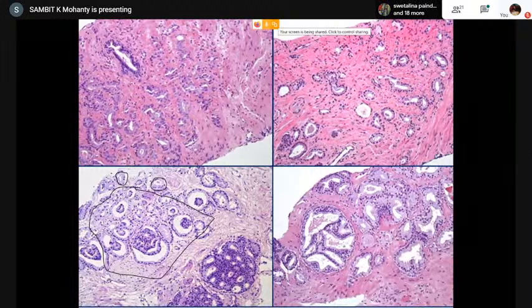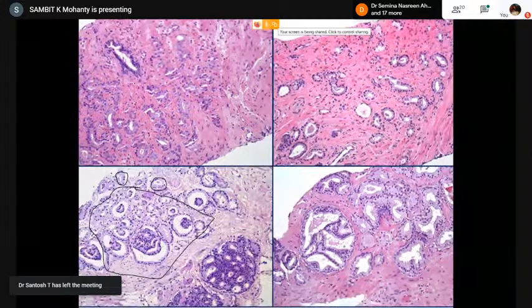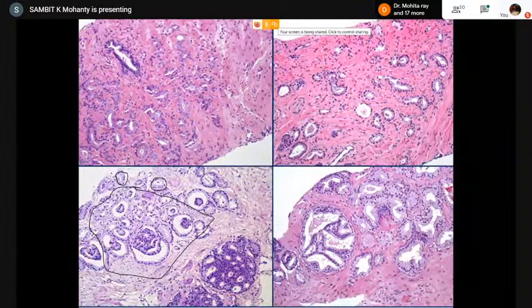So why do you think 3? I mean, you may be right. I'm not saying. Why is it important to say whether it is 3 or 4? Because once you have 4 in a biopsy, watchful expectancy is out. There is no question of telling the patient to wait and watch. They need active intervention.